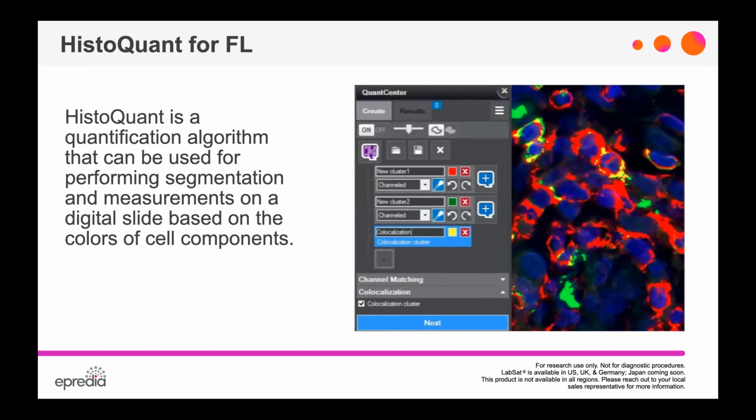Select the area that I want to do and go ahead and churn that out, quantified based on the percentage of the sample that is being evaluated or the whole slide, and the specific channels and colors as we see fit. And we're also able to negate the ones that we're not really interested in, that maybe DAPI is just providing a morphological background. You don't have to include that in the sample counts if you don't want to. So it's a very nice customizable tool. And again, these can be saved as protocols.